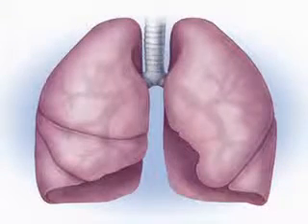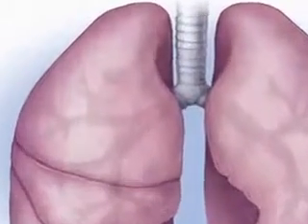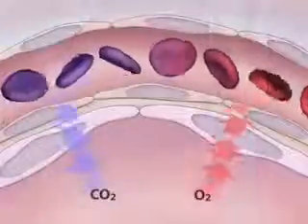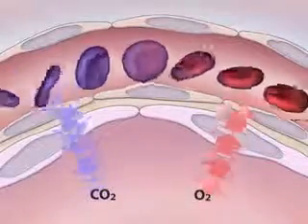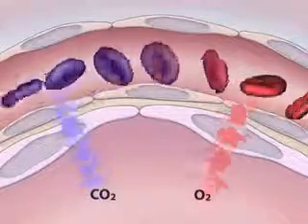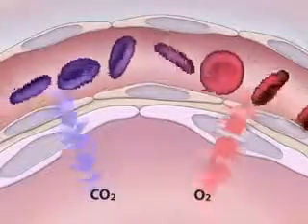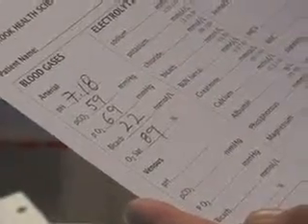Arterial blood gas analysis provides useful information regarding respiratory and metabolic pathology. The partial pressure of carbon dioxide, bicarbonate concentrations, and pH values will assist in diagnosing the presence of primary or mixed respiratory and metabolic acidoses or alkaloses. The partial pressure of oxygen will reveal abnormalities in blood oxygen content and the presence of hypoxemia.